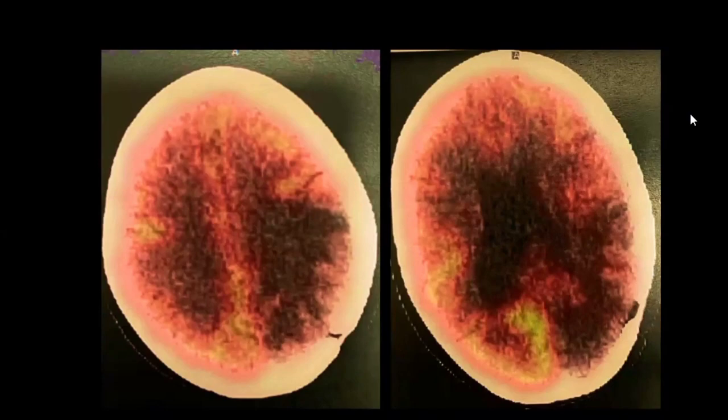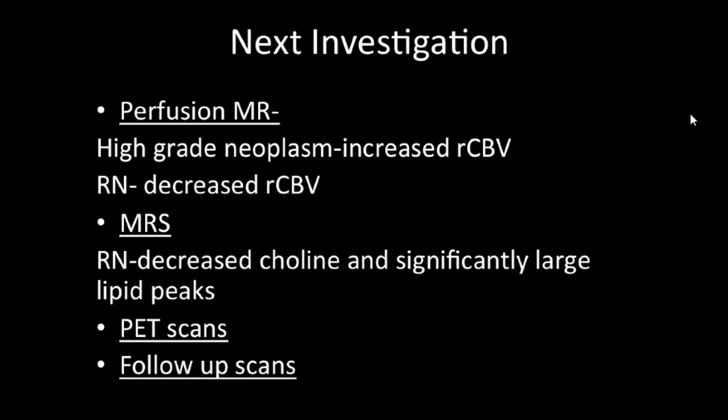It's very important as a radiologist to decide whether it is radiation necrosis, progression, or pseudoprogression, and we should try our best. We should use all of the additional tools as I described in my previous slide, as per availability in our setup, to give a proper guideline to the patient because the management is decided accordingly. Thank you.